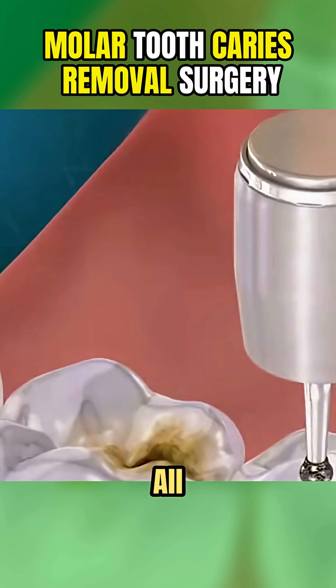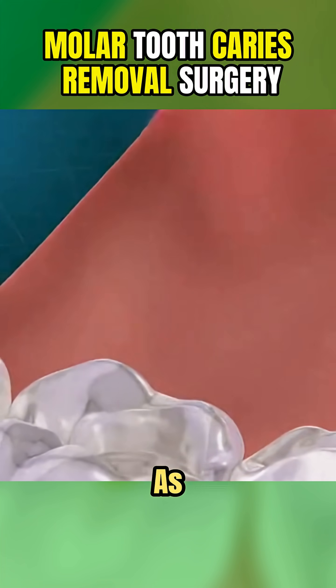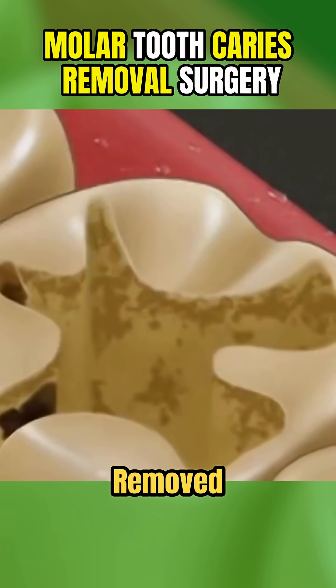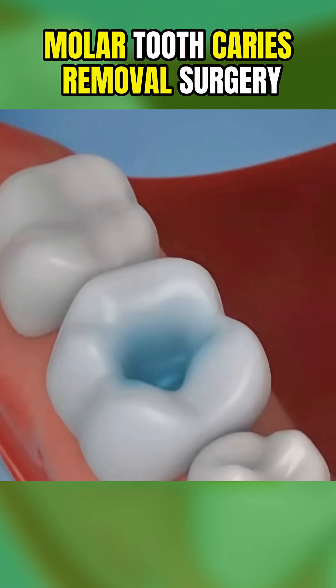The focus is to clear out all infected tissue while preserving as much healthy tooth as possible. Once the decay is removed, the cavity is cleaned and disinfected to make sure no bacteria remain.